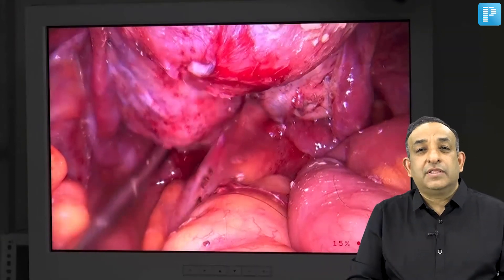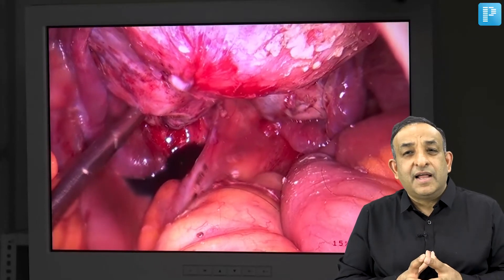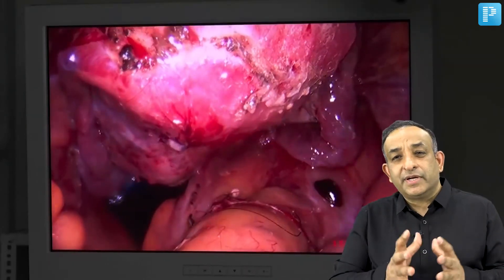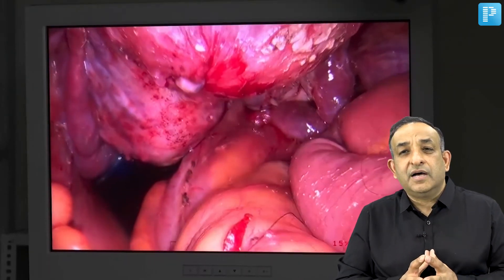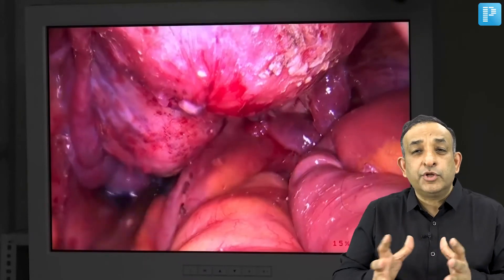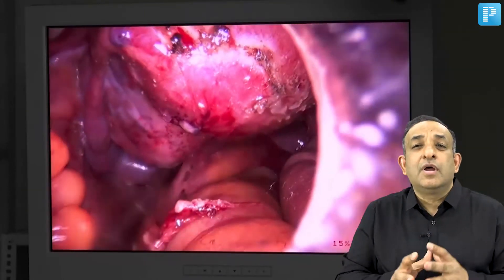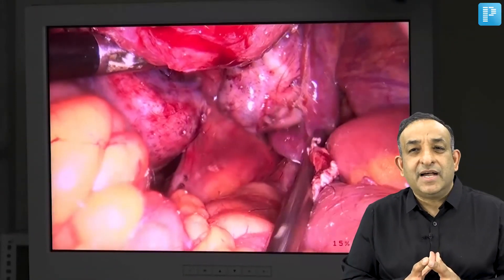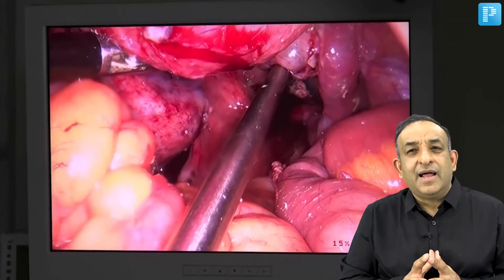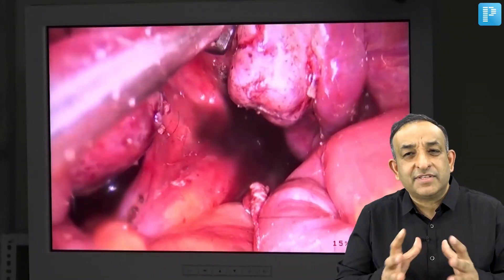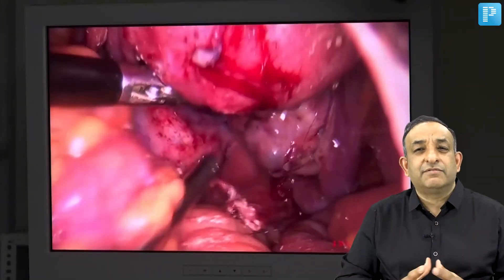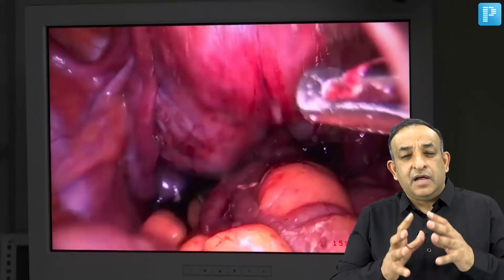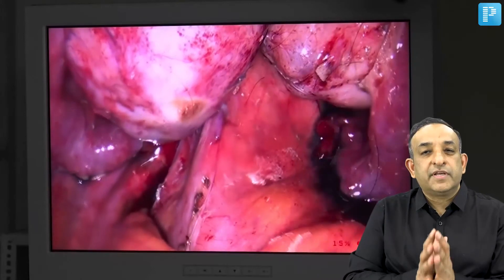The dermoid cyst was so badly stuck that it ruptured and I had to clear fat particles and hair from the uterus and bowel surface. Finally, the pelvis was freed of all adhesions. I then did chromotubation — methylene blue dye was injected — and we saw dye coming from the left tube first, then with additional pressure applied, dye appeared from the right tube as well. This was very reassuring given the severity of the adhesions.